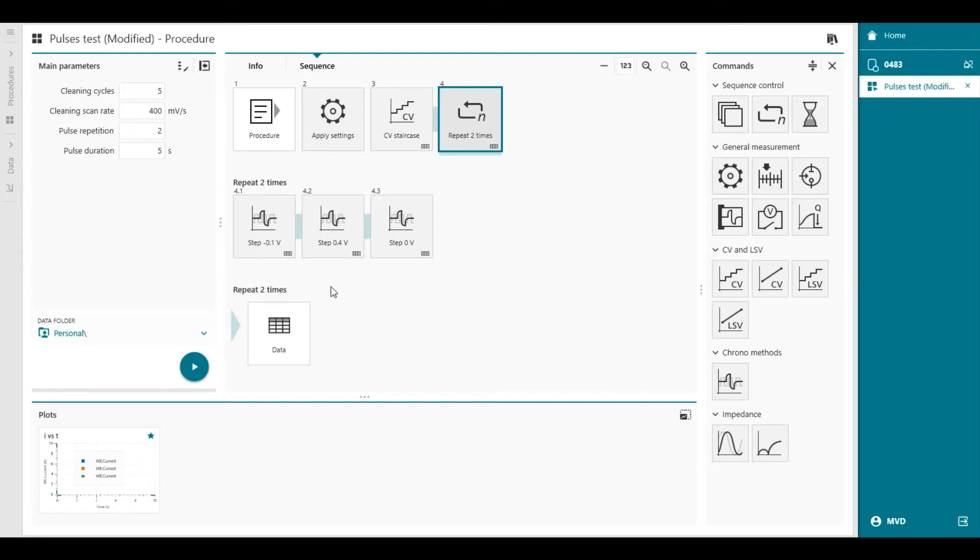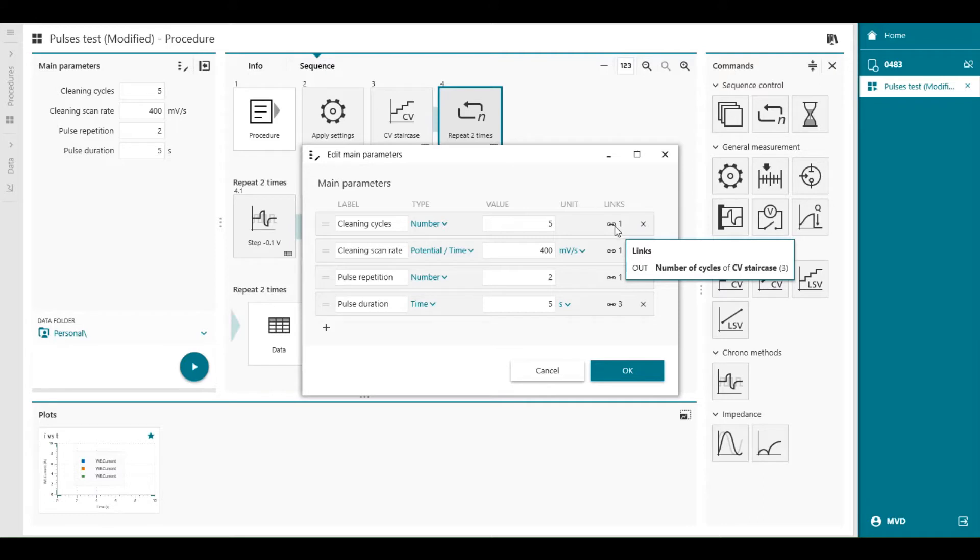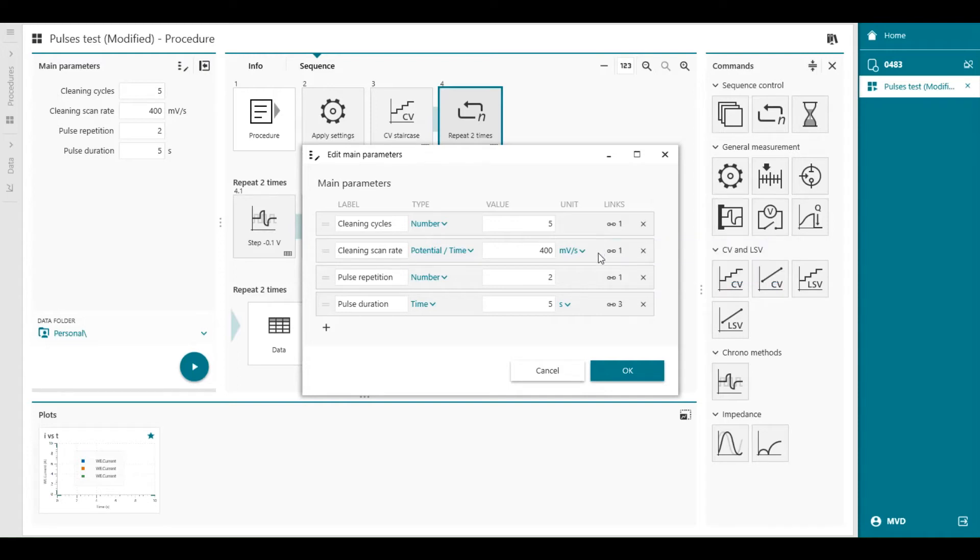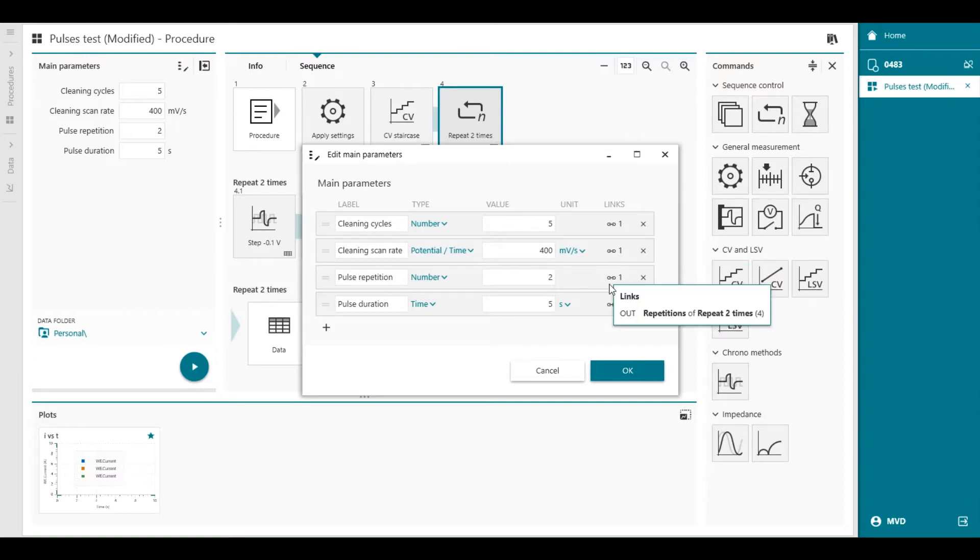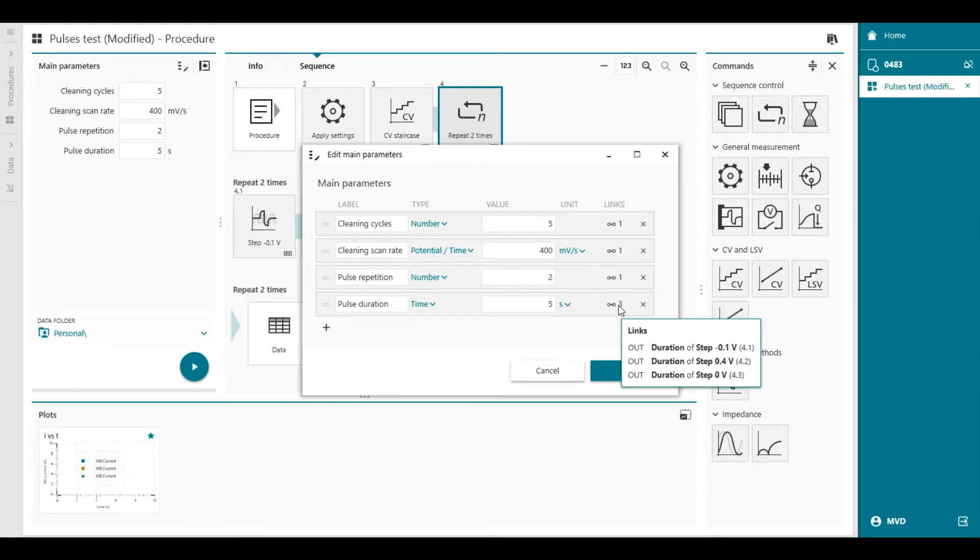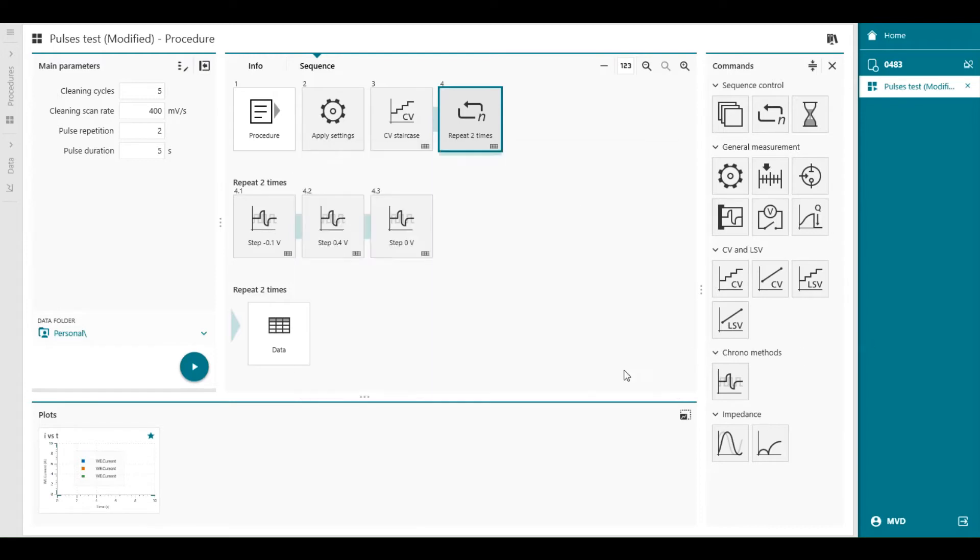Let's focus for a moment on the links column in the main parameter dialog. So you can find here the links column. And each link you will see that is linked to a certain command parameter in the command. So this number is linked to the number of cycles in the CV staircase command. And this number is linked to the scan rate in the CV staircase command. This is in the repeat loop linked. And here you'll find the pulses duration. You can also see that the numbers of each command tile are changed as well. 4.1, 4.2 and 4.3.